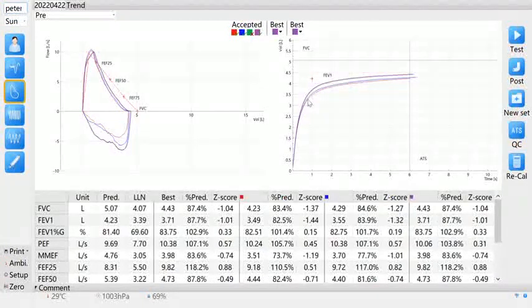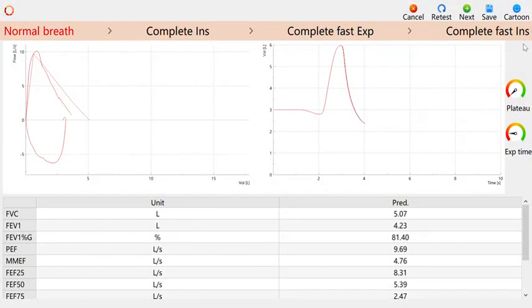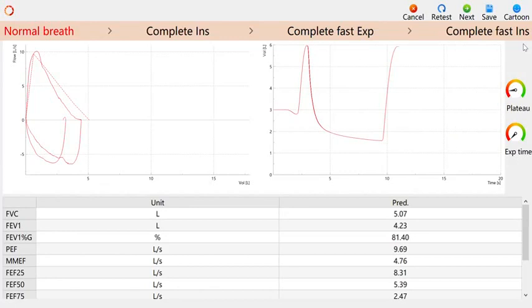FVC also has an air blowing method, which is suitable for older people or patients with lung-related diseases. Click the upper right corner to start the measurement, and then click the upper part to test. Inhale and blow hard. Keep blowing for 6 seconds. Keep blowing and insist. Inhale hard. The blowing is over. Click Save in the upper right corner to save the test results.